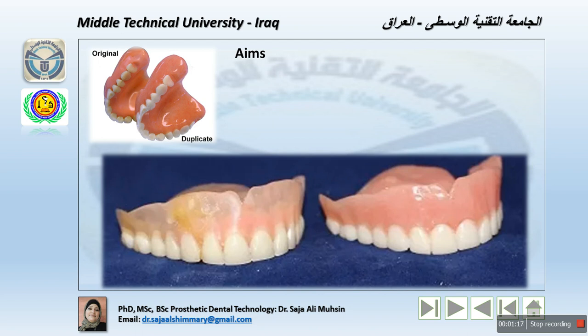The aims of the duplicate denture. Generally, the duplication of complete denture is to transfer the contour form from the old to new dentures for maintenance of neuromuscular control. Also, the modifications to the basic shape of the old denture should therefore be only those necessary to correct, for example, loss of fit. Sometimes patients complain about the old denture, so we need to duplicate this denture. And those considered essential by the operator, for example, a slight increase in the occlusal vertical dimension, and the replacement of the worn denture teeth.